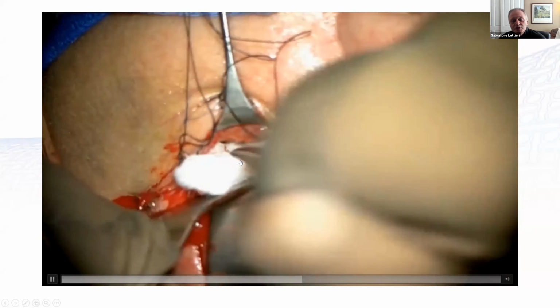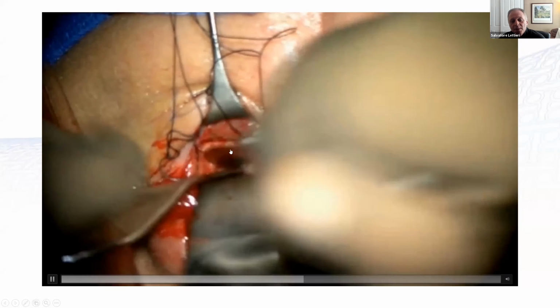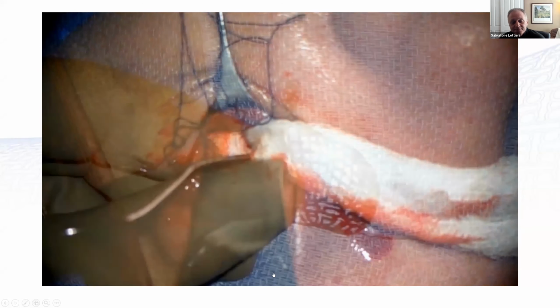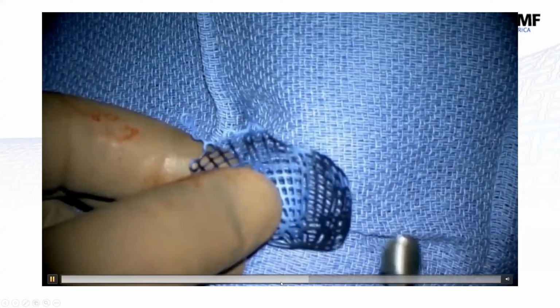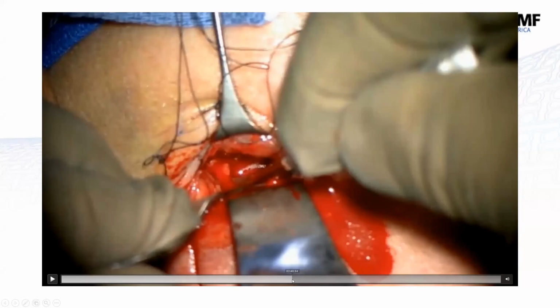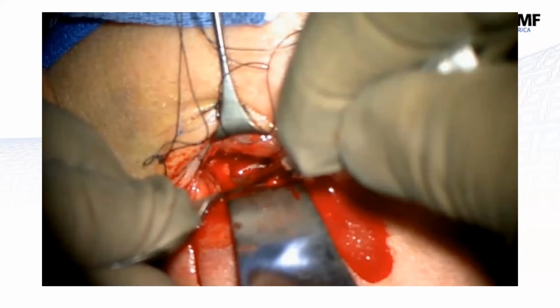So now what I do is once I've found the posterior shelf, I'll pack, what's it? Oh, sorry, Sal. Could you comment on, let's say you're dissecting back doing that technique and you're having bleeding. Have you used preoperative injection with epinephrine, and do you use anything intraoperatively for hemostasis? So for the eyelid, 1% lidocaine with 1 to 100,000 epinephrine. I do not inject the floor.